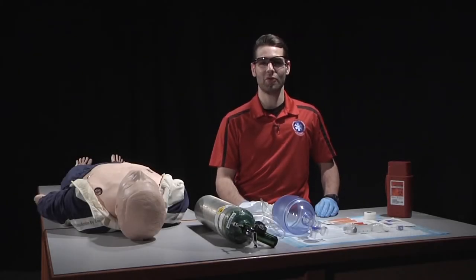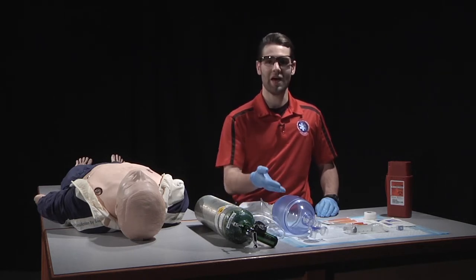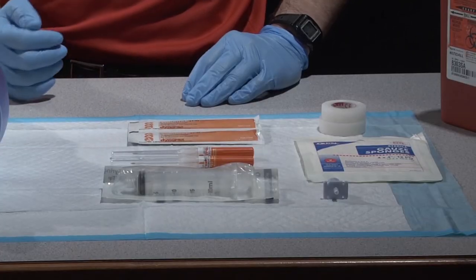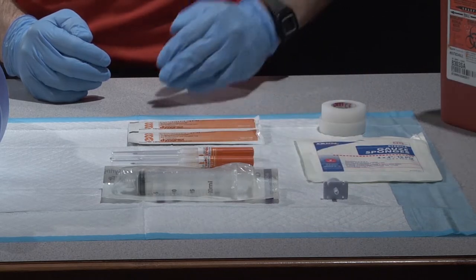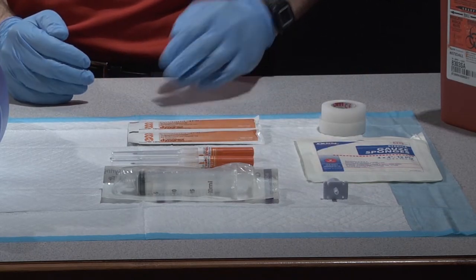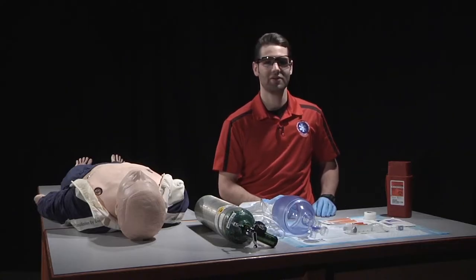This is the needle cricothyrotomy skill. The necessary equipment for this skill is an oxygen source, a BVM, a large bore IV catheter, a syringe, a 3mm ET adapter, solution to cleanse the site, gauze, tape, and a sharps container.